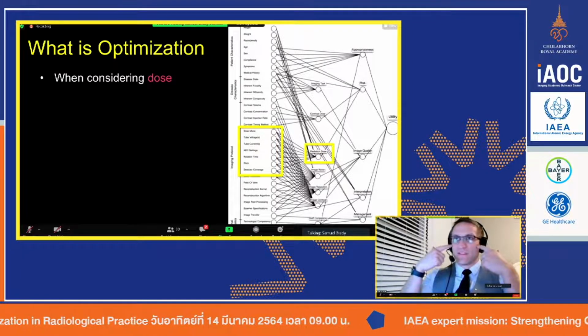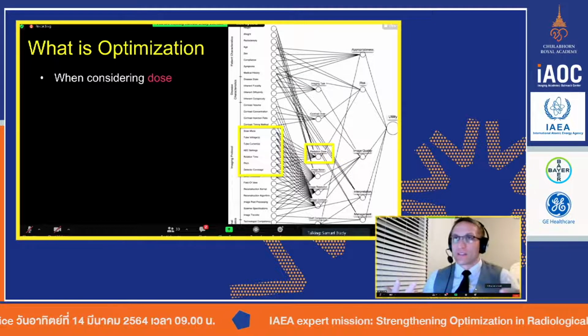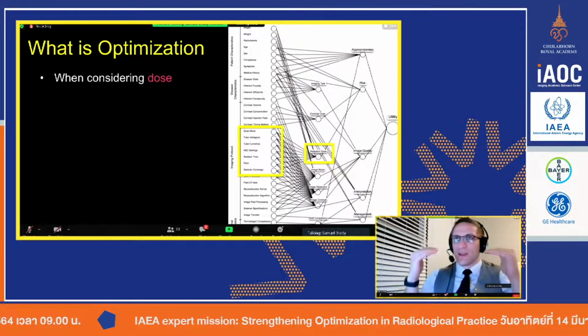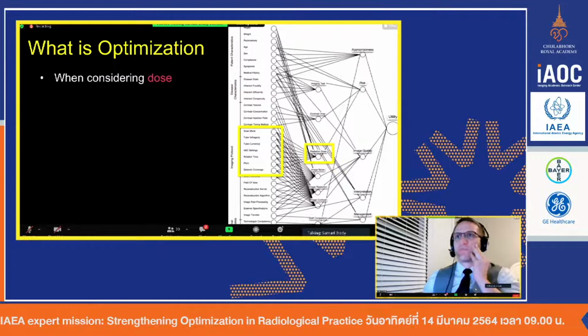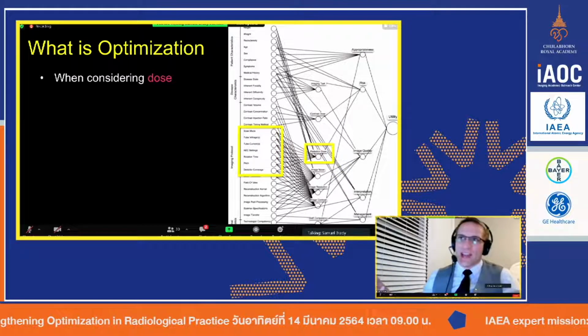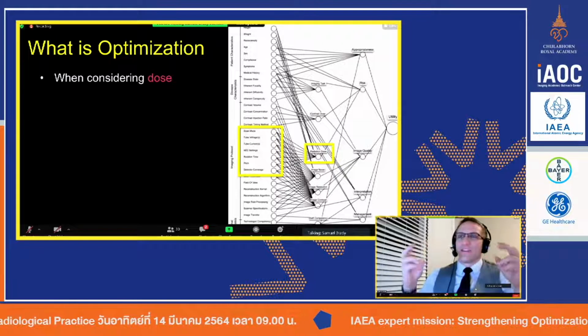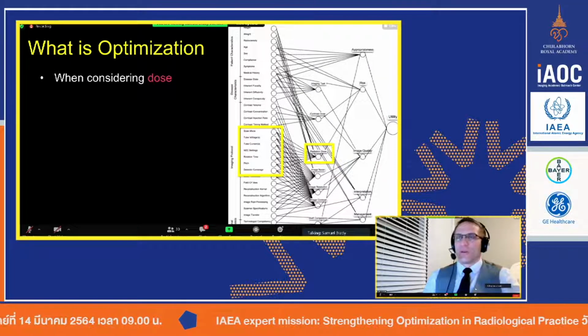Orbits, soft tissue for the face. You need to have the right noise content, but that's kind of the same as the brain. You just optimize the right mA. Obviously, there's still bone in the face, but not as much since we don't have the cranium. And if you're doing sinuses, it's mostly air-filled. It's an air-filled cavity that could potentially be filled with infection, so water or fluid-based.